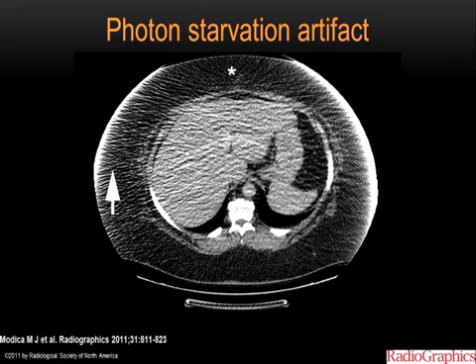Again, artifact, photon starvation, basically because the mAs is too low, the kV might be too low to be able to penetrate through the patient, and as a result, there is hardly anything that you can see in the liver in this case.